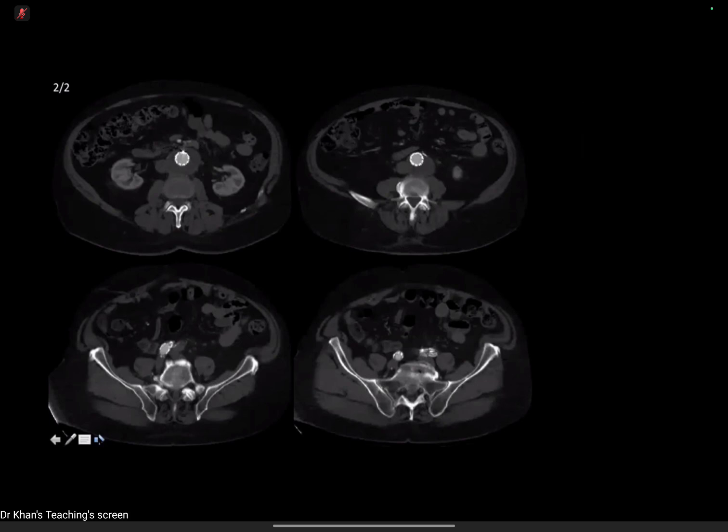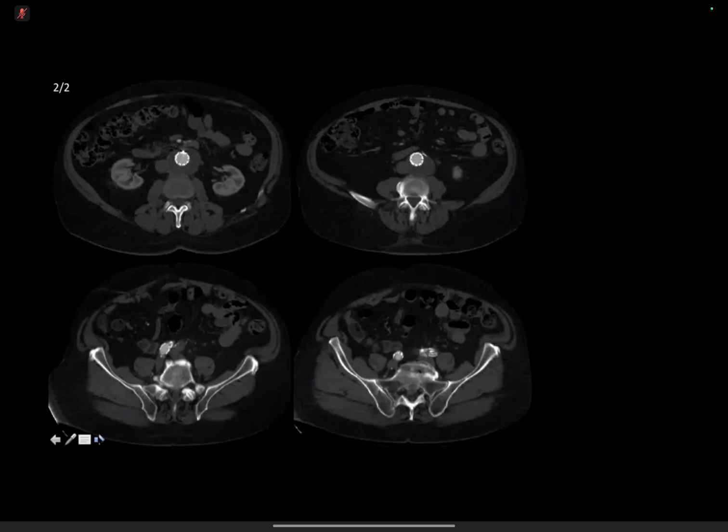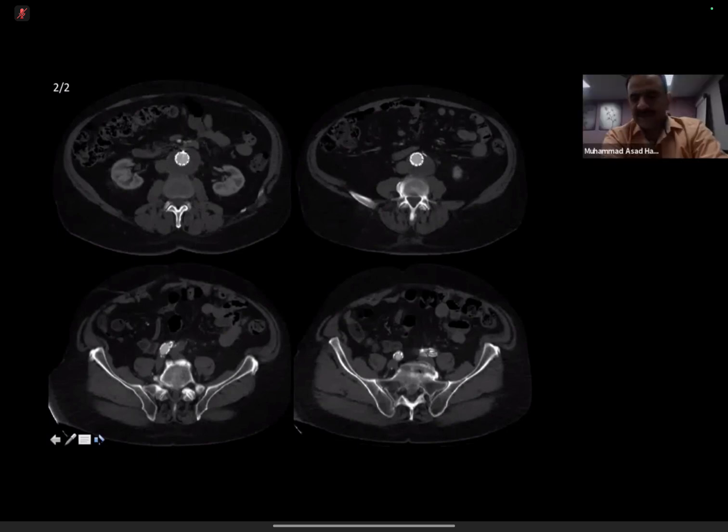There's also circumferential thickening around the stent, which is the previous aneurysm sac. I think there's a filling defect in the right common iliac artery. Okay. As well, so which may represent thrombus. Okay. Well, that's just a partial voluming. Okay. So I'll show you one more image, and then we'll come back to these images.